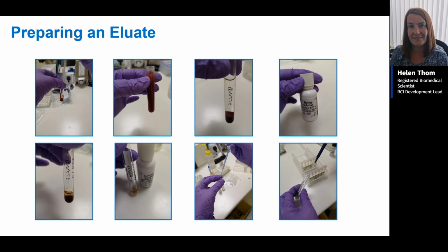So in terms of washing in this sense, you rinse it. You'll put the ml of red cells in, put the wash solution in, give it a mix, centrifuge it, take off the supernatant, and then keep your red cells. Repeat that process about 4 times, I think it was, when I used to work at the lab. And you're just getting rid of anything that you don't want to be testing at that time. So you end up with a ml of packed red cells that have been washed, and you get rid of your supernatant.